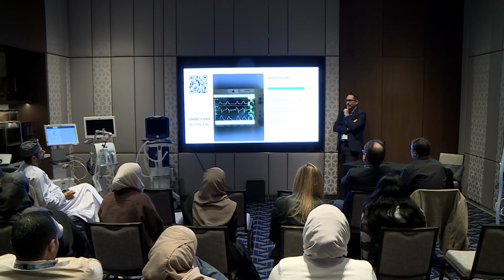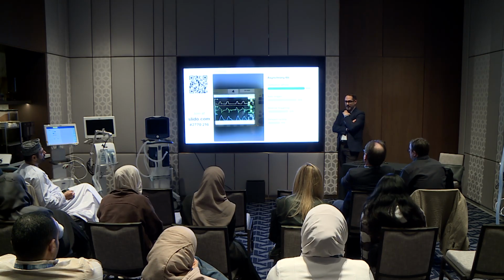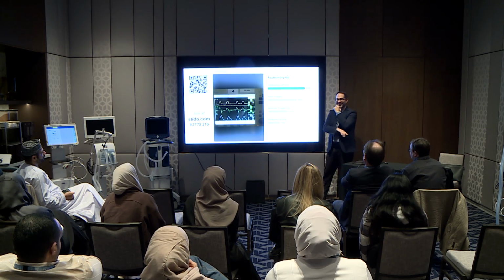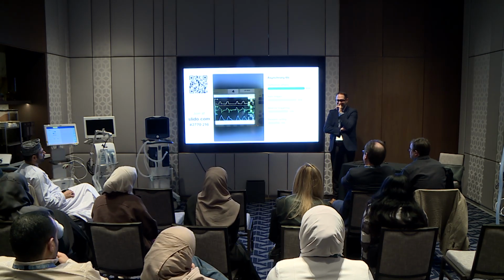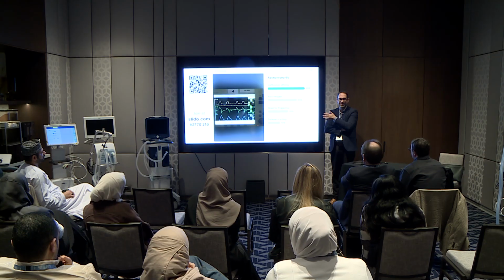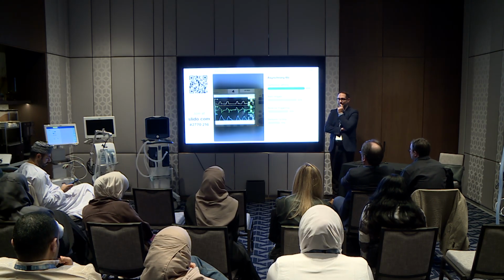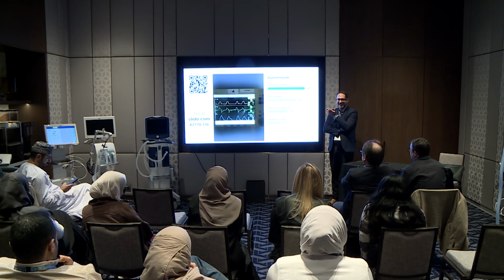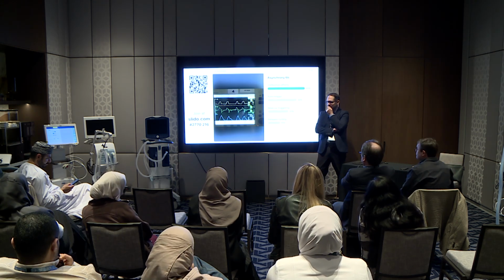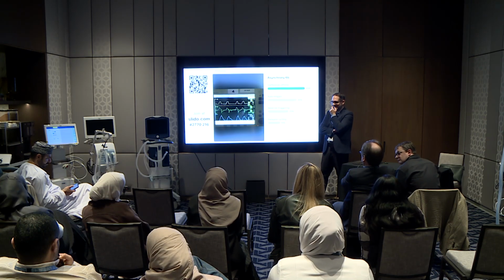40% had the incorrect response. The second option there is auto triggering. Yes. Now, what's funny is, who said reverse triggering? Because there actually is reverse triggering here. Anybody? Who chose reverse triggering? Because you're right, there is reverse triggering. It's not the main problem, but did anyone want to admit that they chose it? I did. Okay, good. Is it in all the breaths you think? I think it's the second one. It is, this is the second one, yeah.